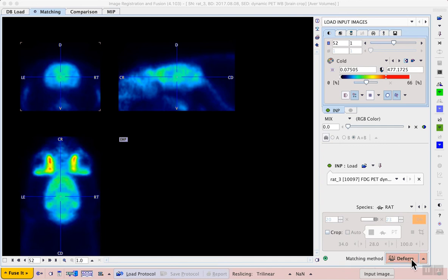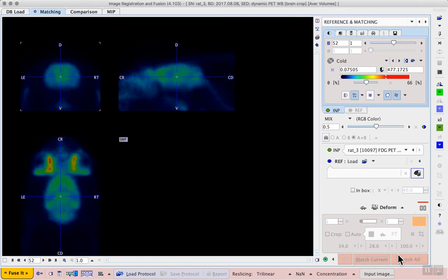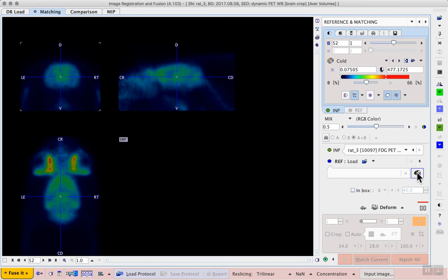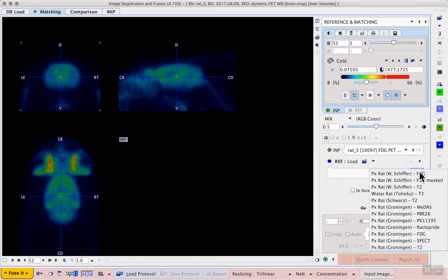We can now proceed with the deform workflow using the usual workflow button, and this takes us to the reference and matching page. Here we can select the template to be used. In fact, we have two rat brain FDG templates available. These can be accessed from the templates button on the right hand side, where we have an FDG template corresponding to the PX-RAT Schiffer Atlas.